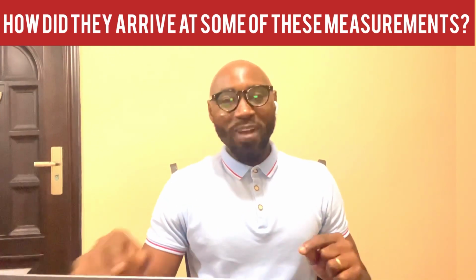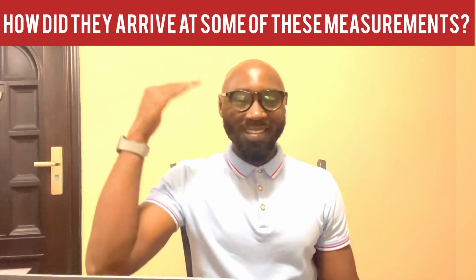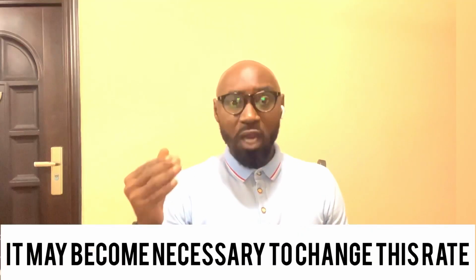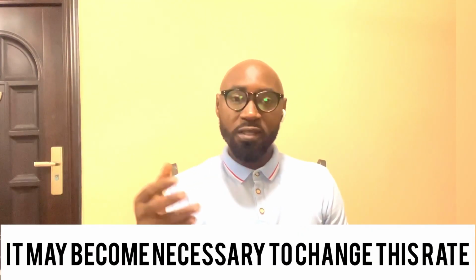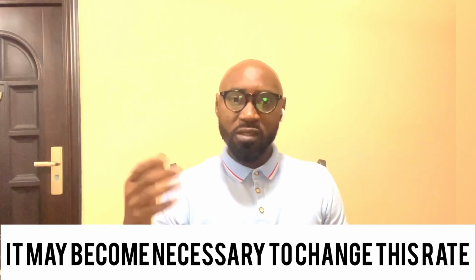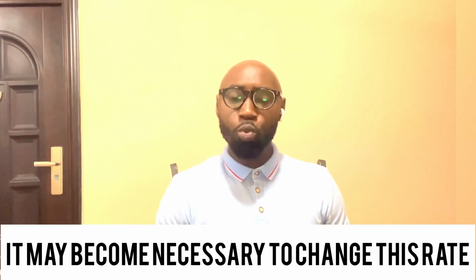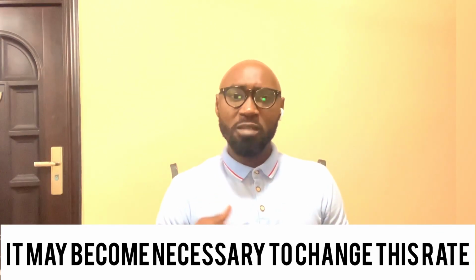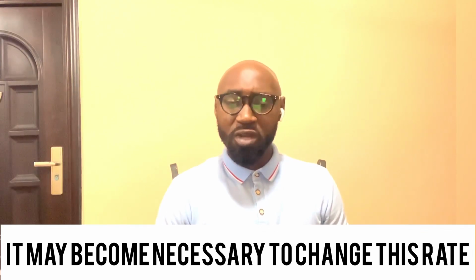And as a matter of fact, the senior colleagues may find it necessary to either increase or decrease some of these rates or these settings. Sometimes it helps them to define some wave abnormalities, and sometimes may even help them to appreciate or check for some arrhythmias.